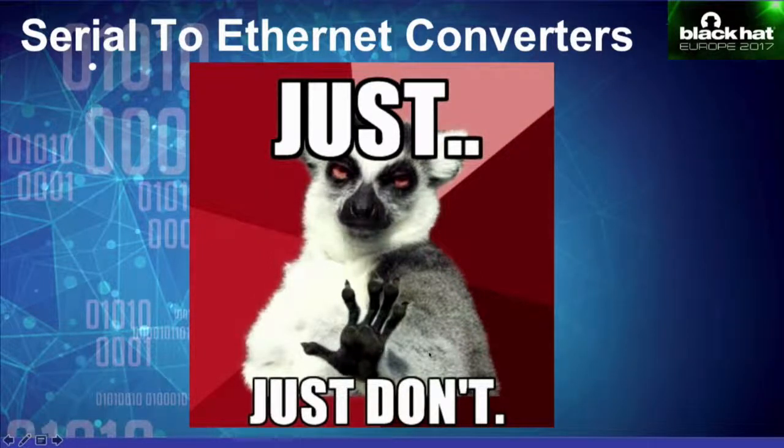And so there were several vulnerabilities discovered and reported in this particular piece of hardware. One was that it allowed remote attackers to remotely break into the device and retrieve sensitive information without providing any authentication. The other was that an attacker could again remotely connect to the device and upgrade or downgrade the firmware of the device itself without any authentication.